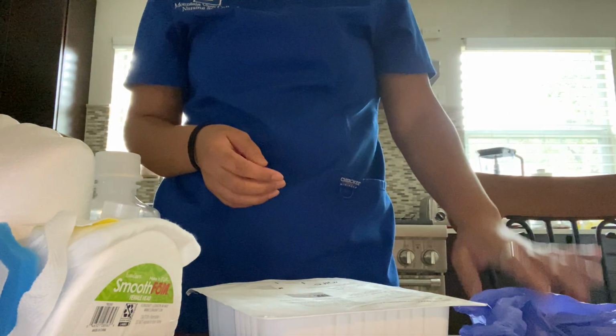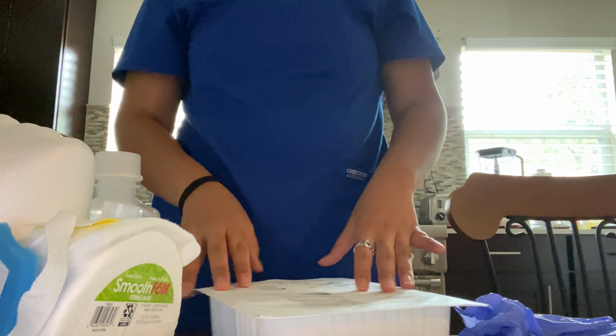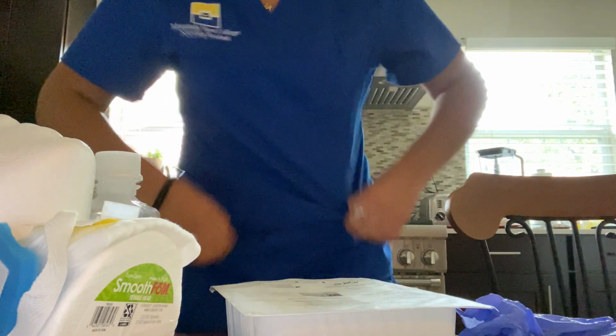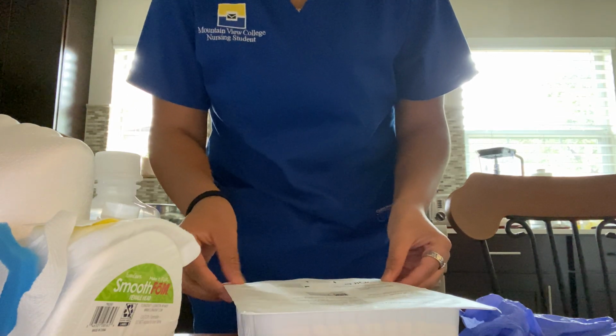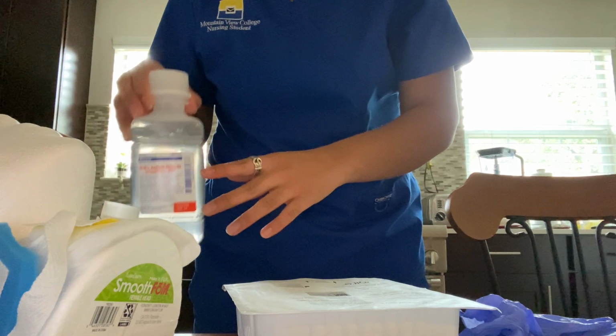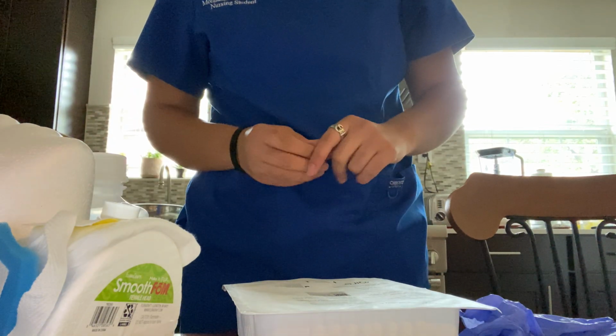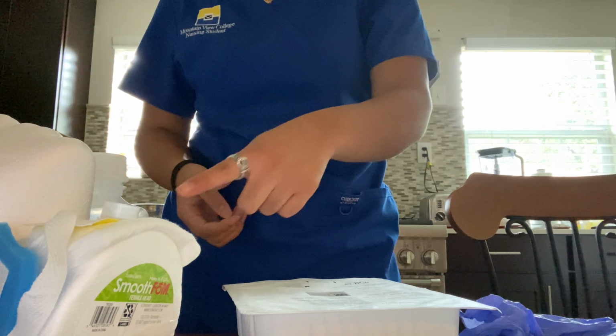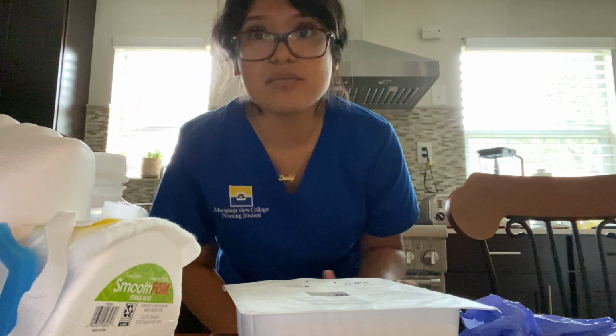So that is all that we have, and we are ready to go. We're going to make sure we're checking all the expiration dates on everything, making sure they're good to go. Okay, everything is good.